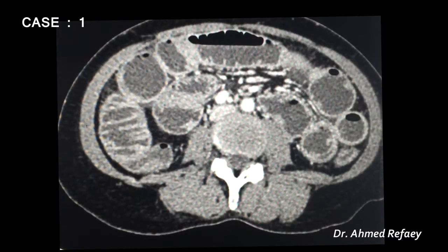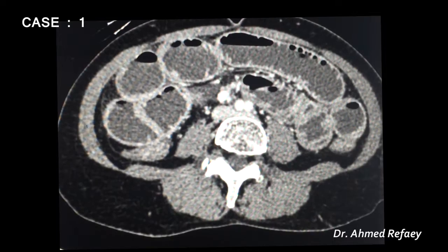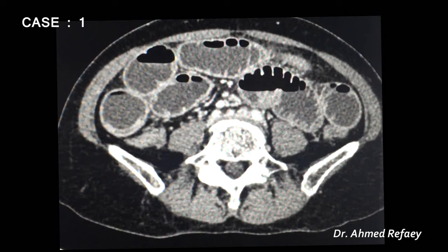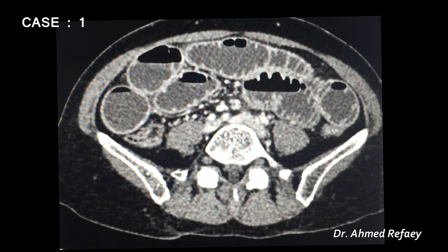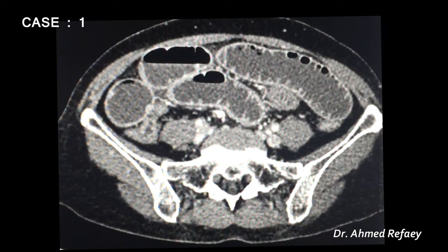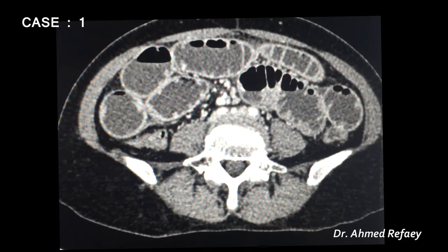The axial CT images reveal marked dilatation of small bowel loops with characteristic valvulae conniventes. The small bowel is filled with fluid. The best way to localize the cause and level of obstruction is to start from the distal collapsed small bowel loops, tracing from the region of the cecum.